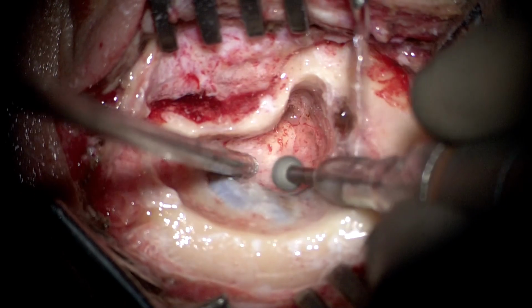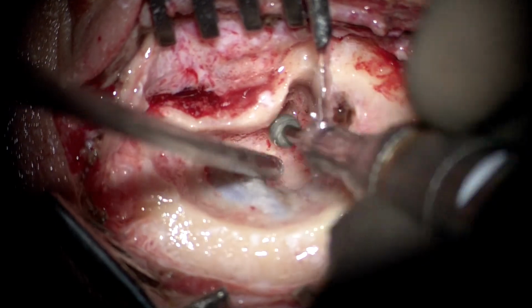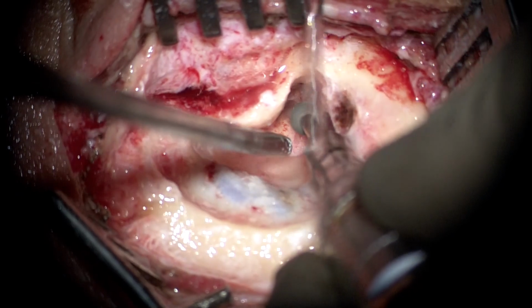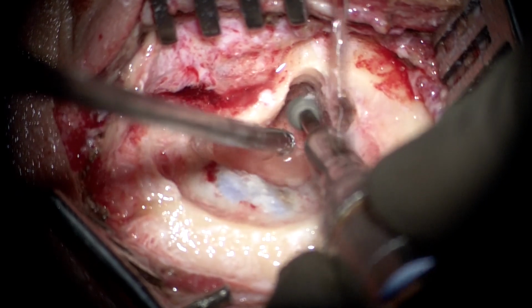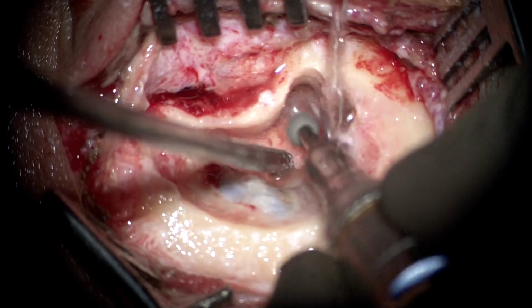We are again now drilling some bone medial to the sigmoid sinus. This bone normally is the retrolabyrinthine bone, which covers the posterior fossa.